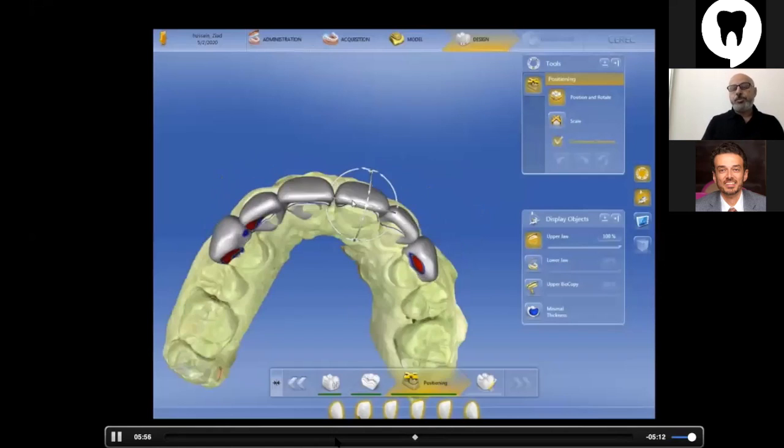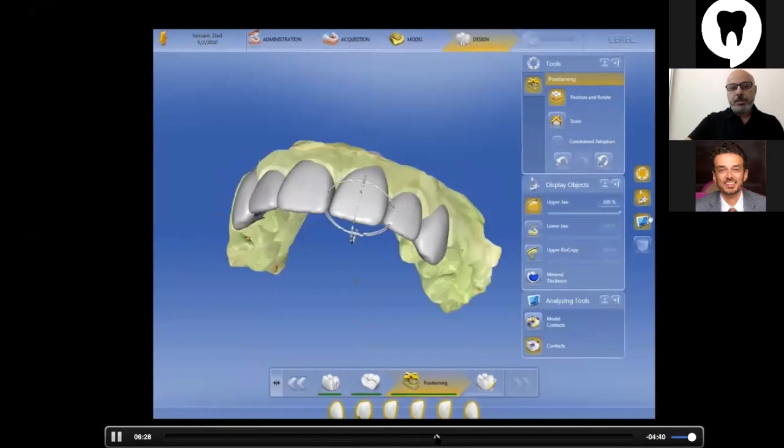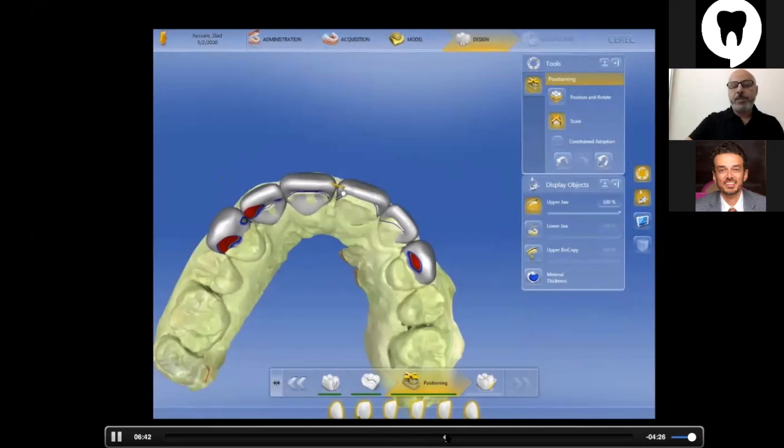The next step is to reposition everything. You have to position the teeth according to the alignment you need, according to, of course, your lip support, according to, of course, your smile arc. Align them before you see the final design. This is very important. So this is the teeth alignment by reshaping, by increasing if you like to increase the width, buccolingual or mesiodistal, and then even move them labiopalatally or mesiodistally to adjust that line.